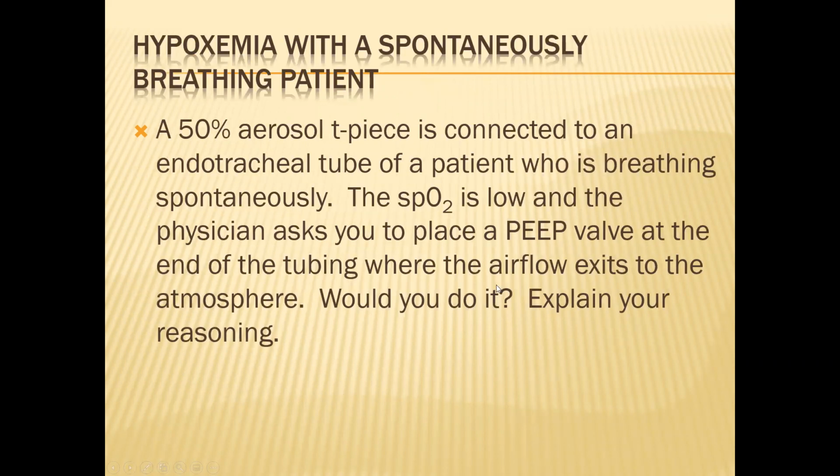All right, so do you want to do this one and then we'll take a break? Yes. Hypoxemia with a spontaneously breathing patient. 50% aerosol T-piece connected to an endotube of a patient who is breathing spontaneously. The SAT is low. Physician asks you to place a PEEP valve at the end of the tubing where the airflow exits to the atmosphere. Would you do it? Explain your reasoning.